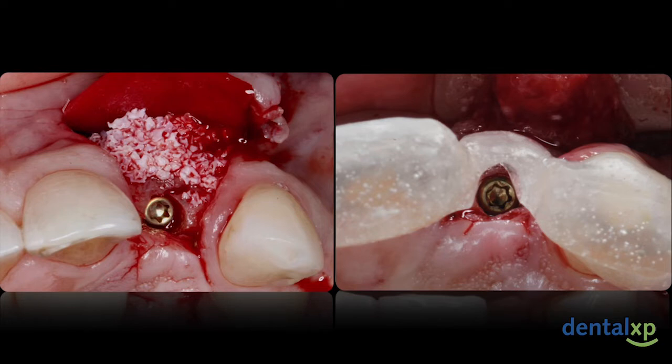At that point, we went on and we did an additional buccal contour graft with a slow resorbing xenograft material and a small collagen membrane for added augmentation and to compensate for any further resorption that may occur.